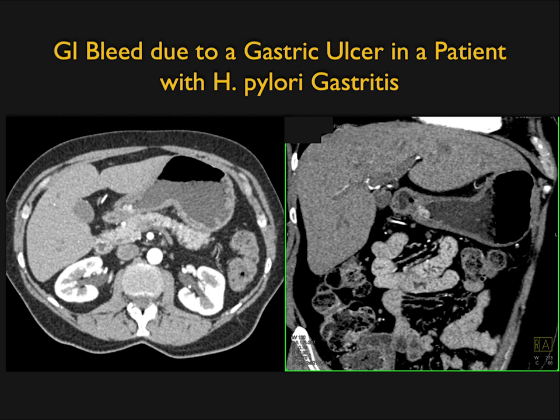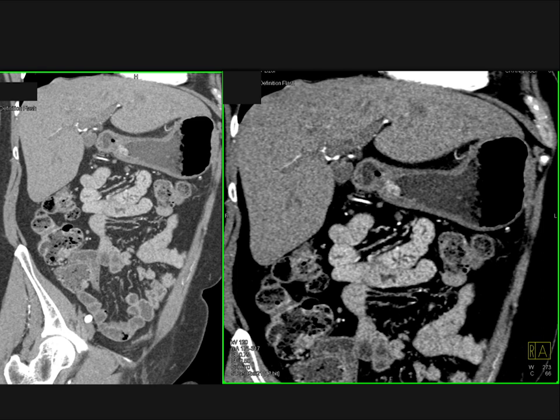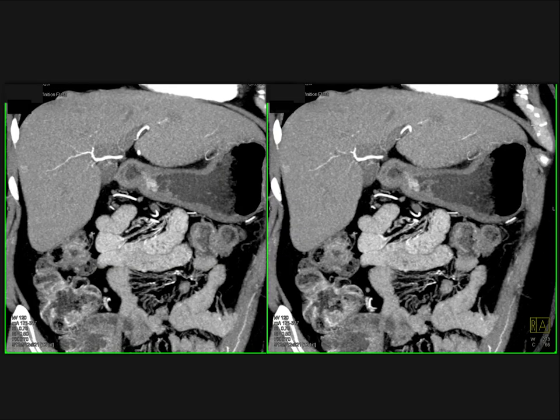Another patient with GI bleeding and a history of H. pylori gastritis. There's thickening of the antrum and a high-density zone — that's a GI bleed, very nicely shown. Doing reconstructions in coronal planes and 3D is very helpful. You could argue whether this could be a vascular tumor, but looking at the arterial and venous images together, you recognize it was a source of active bleeding.